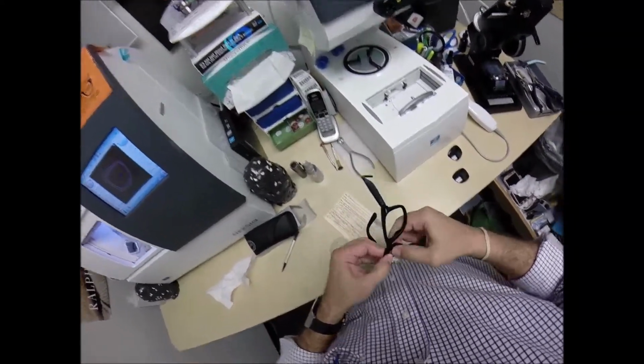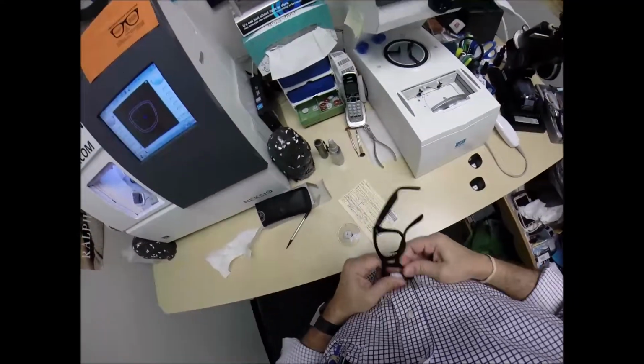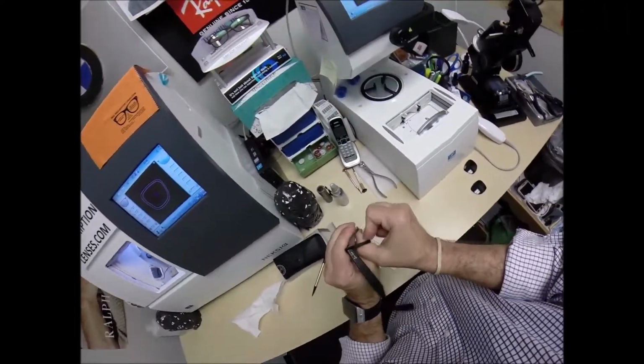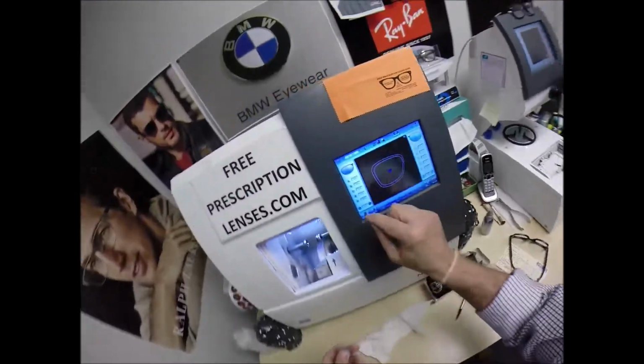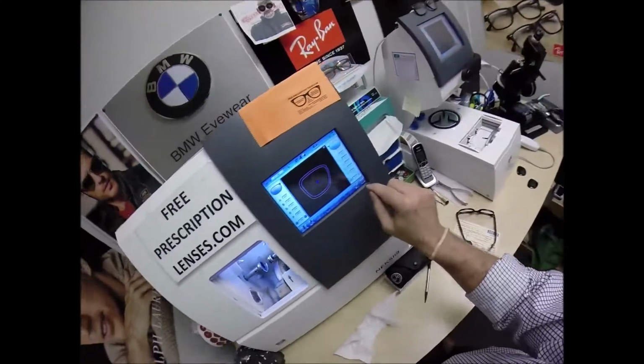So tuck it in at the outside corner, push down at the nose. Yeah, let me take it down a little bit more. Let's do about 65. I'm going to do 0.15 instead of 25 this time. Hit retouch.